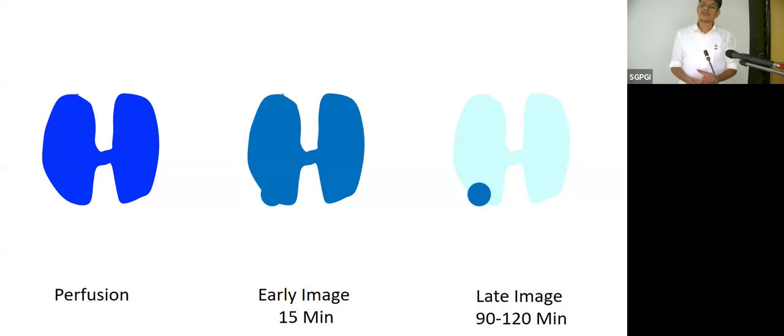As we look at 15-20 years of nuclear medicine, previously patients with parathyroid disease were coming with palpable glands. Now they are coming with just raised levels of PTH with a normal ultrasound. So the sensitivity of even the parathyroid scan is decreasing from 92%. It has become almost 60-65% in those patients who have a negative ultrasound and only mildly raised parathyroid levels.